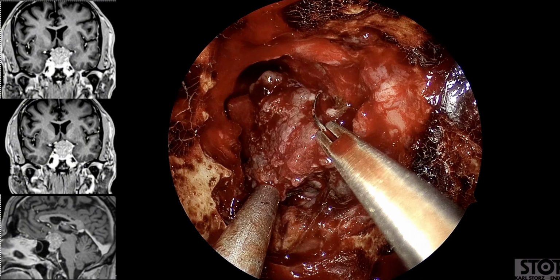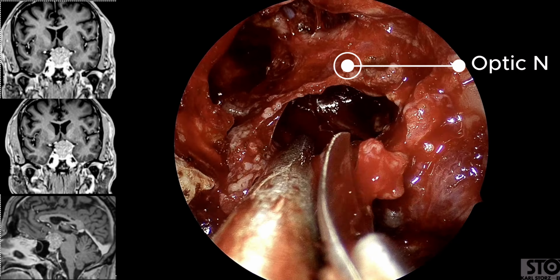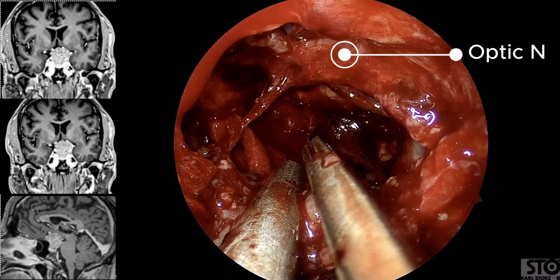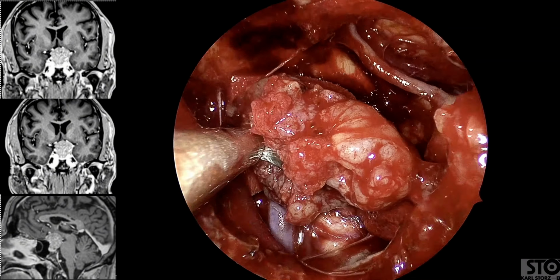We then carefully dissect the tumor from the optic nerve, which is often encased by the arachnoid in this case. The distal ICA, anterior cerebral artery complex, and final tumor portion are identified and resected in a controlled fashion.